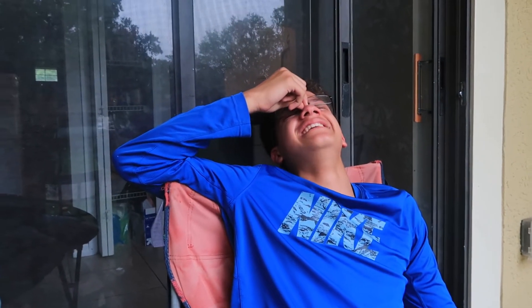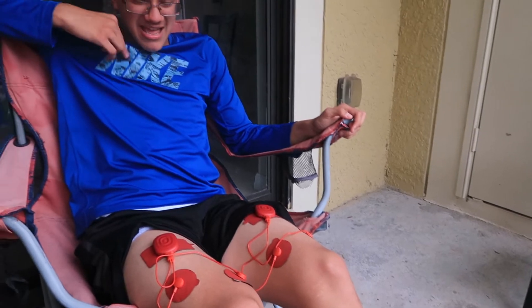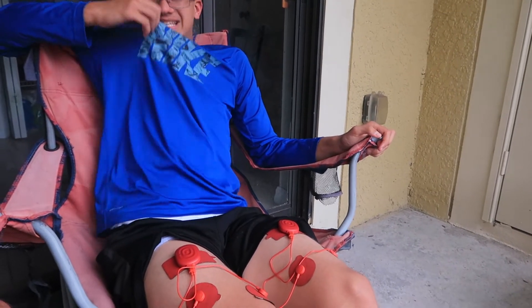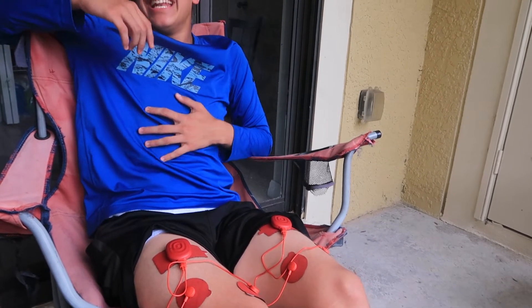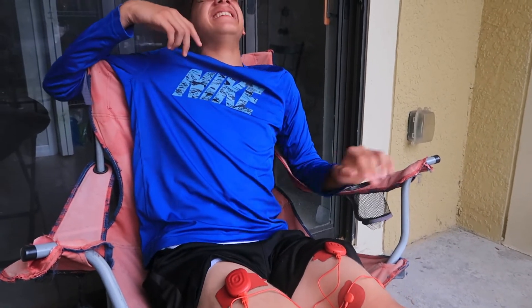So it's just pinching your whole entire leg and you can't do anything about it, right? Let's get one more in. That was funny, bro — I didn't expect you to scream that much. I only put it up one more level and he just kicked. I didn't expect it either.